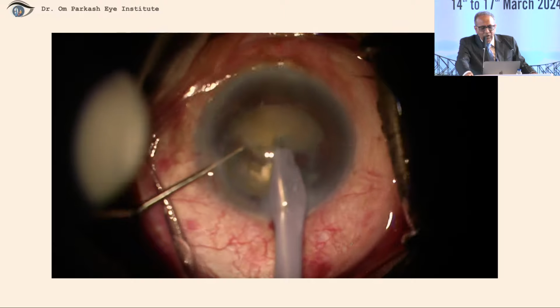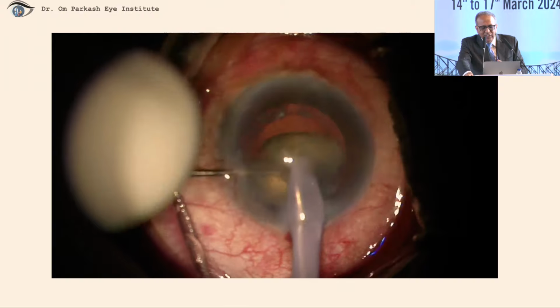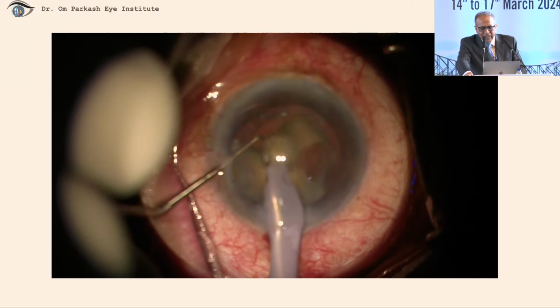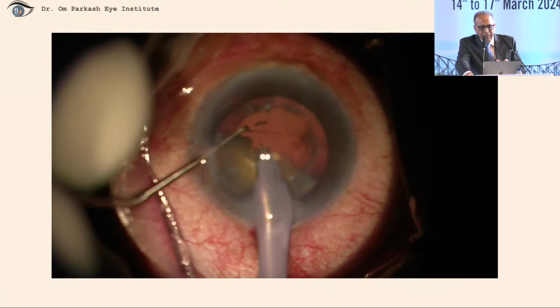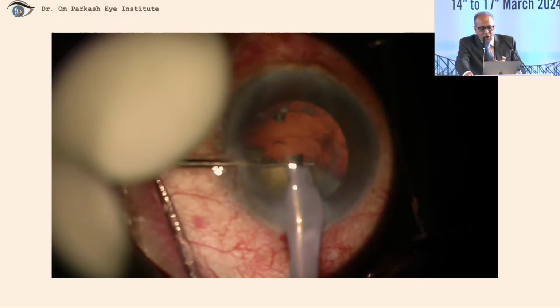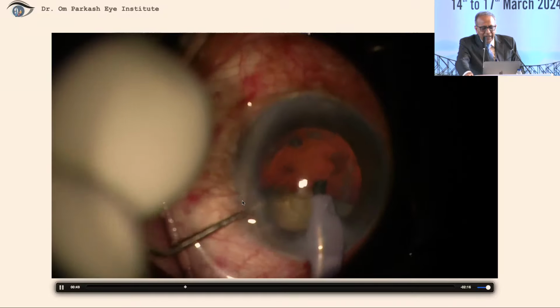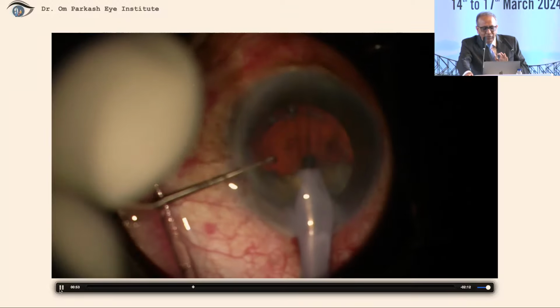Just holding it, moving it up, doing it slow motion. You will see that there is least amount of chatter because I'm doing it in a very slow, guided manner. And you will find with this low IOP, nothing is going behind. Now I find that I am caught on the wrong foot, because there is an open capsule behind, and how do I rotate it? Now can you see that there are slight folds on the corneal side. This shows that it is not fully inflated.